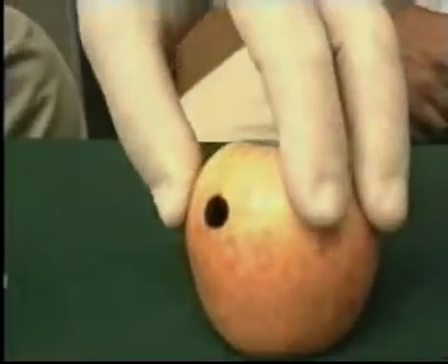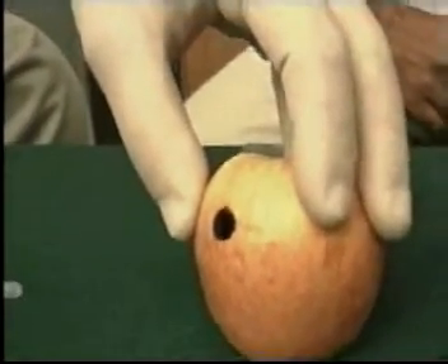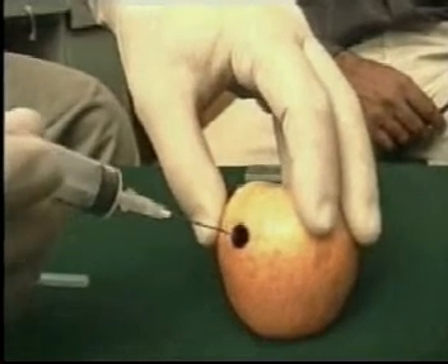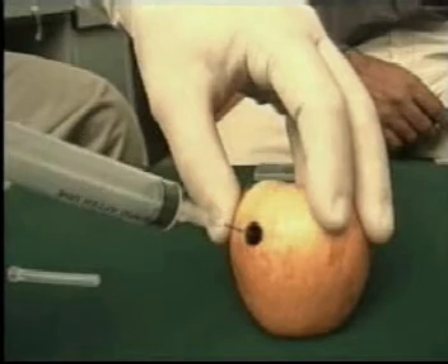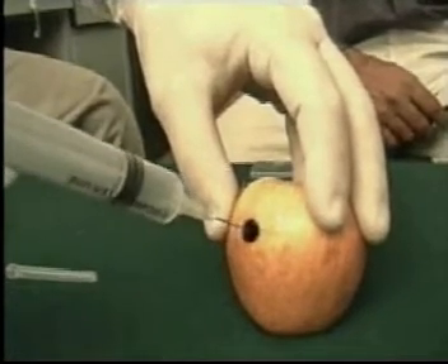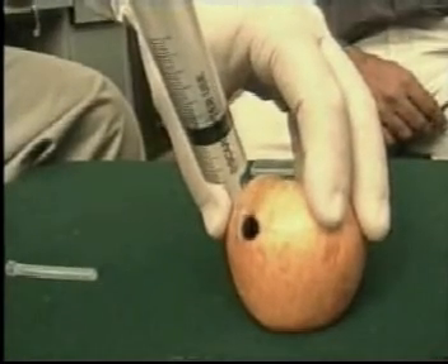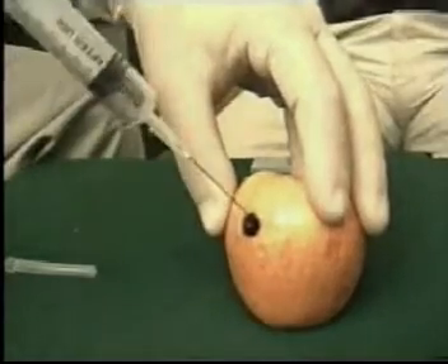Once you've taken the syringe, remove the cap and hold the growth or the organ in which you are supposed to do the FNAC with your left hand. With the right hand, go through the skin entering the growth. Once inside the growth, a negative pressure is applied, and it is a good idea to make a few passes in different directions while you are inside the region.